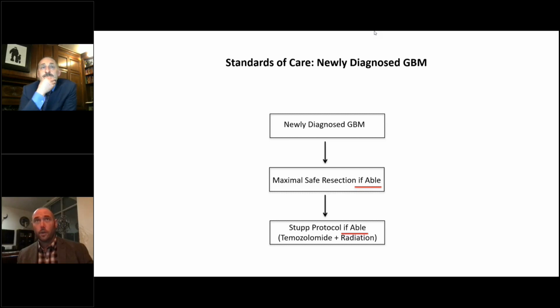Yeah, so we have now done over 100 cases, and I have never had a bleed from the laser. I have had a bleed from the biopsy, which then precluded the laser, or at least did not allow us to get as good coverage, because as you can imagine, the laser doesn't work very well underwater, or under blood for that matter.